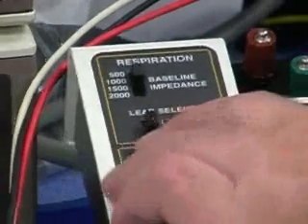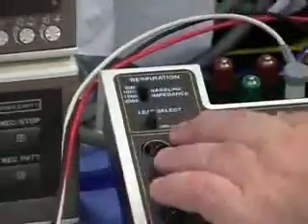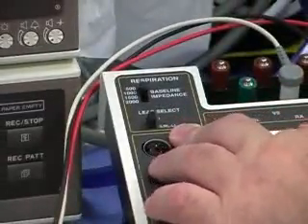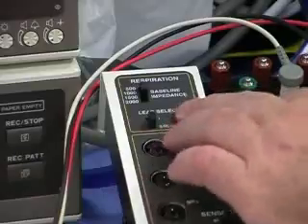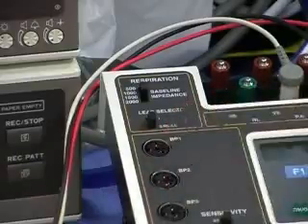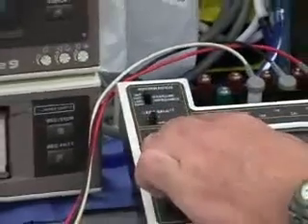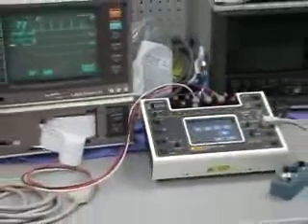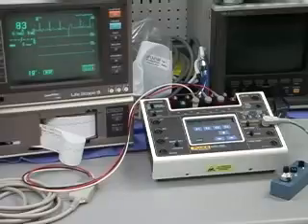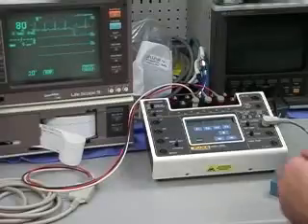And we also select the lead at which the respiration comes out on the ECG leads. Most monitoring companies run lead 1. Apparently, I know that the Philips runs lead 2, or right arm to left leg. Especially when you're doing monitoring, right leg and left leg, or the lower portions of the chest, is where you really get the majority of the impedance variation during respiration.